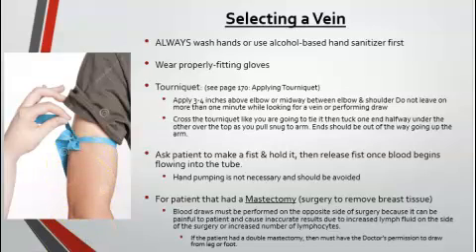You can ask a patient to make a fist and to hold it, then release it once the blood begins to flow into the tube during the blood draw. It's not necessary for a patient to keep pumping their hand during the blood draw.